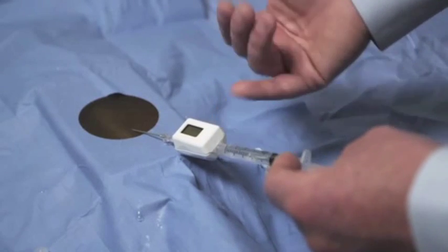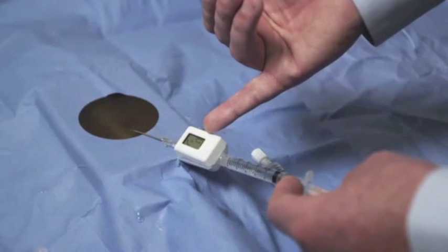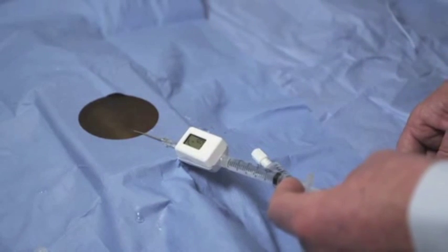After the saline is infused, simply read the compartment pressure. In this instance, we see a pressure of 17 to 18 millimeters of mercury.